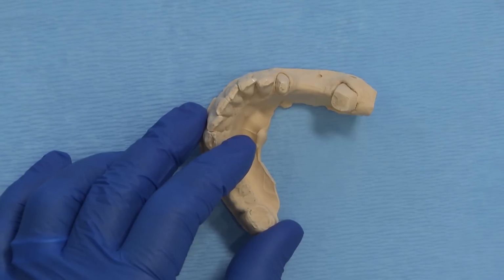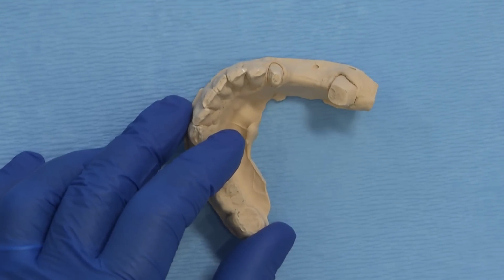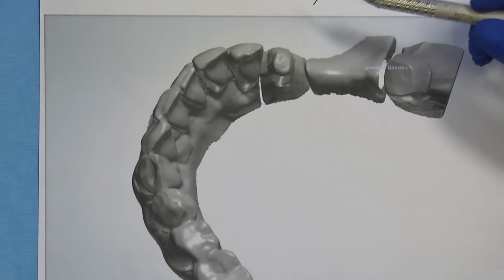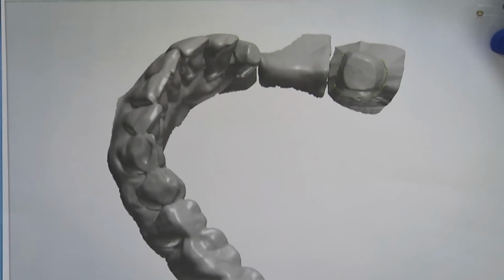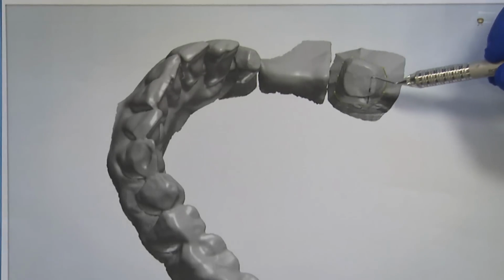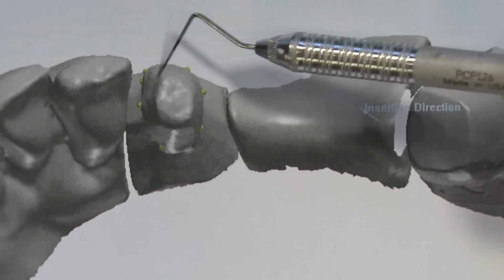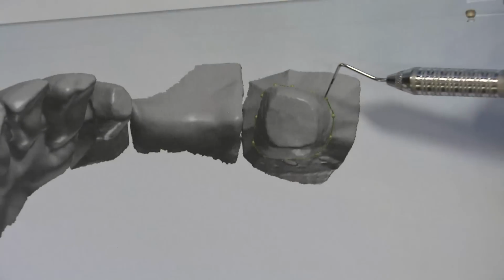It is clinically challenging now because the only way I get to see the view that the technician gets is if I take a digital impression and look at the scan. From this scan image, I can evaluate the draw and pinpoint the undercut and go back to the mouth and make the necessary adjustments while I have the patient in the chair. With this doctor case, you can see here that the designer technician had a better view from the scan than the doctor got in the mouth.